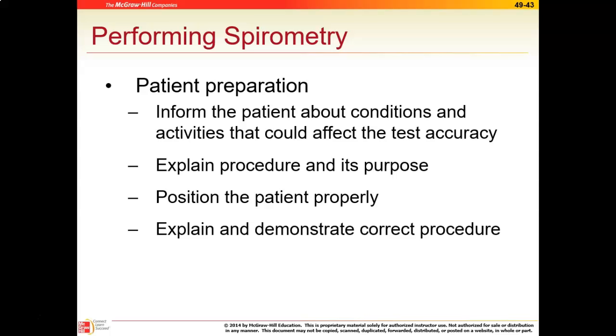And then other things to prep the patient are to let them know what you're doing. So, inform them why we're doing this, what the purpose is, and then explain that if the test isn't done properly, we won't get accurate results. And so, although this test can be a little difficult to do, it's not painful, but forcing the air out for a specific period of time can actually be more difficult than you think. And so positioning is important. And you might even have to go through and demonstrate the procedure yourself first in order for them to completely understand what they're supposed to do.